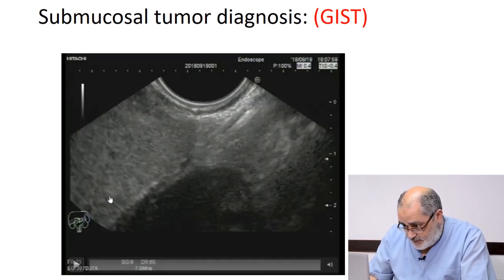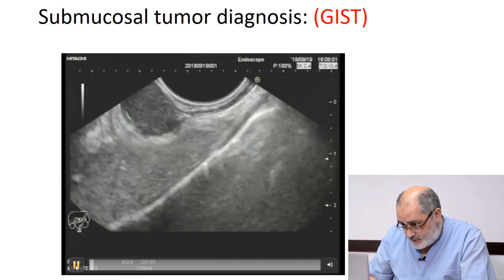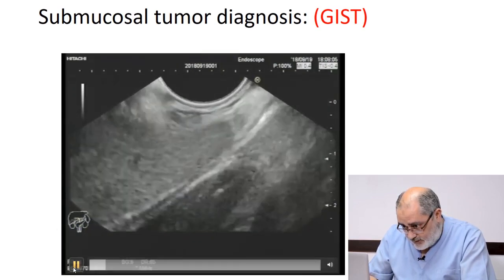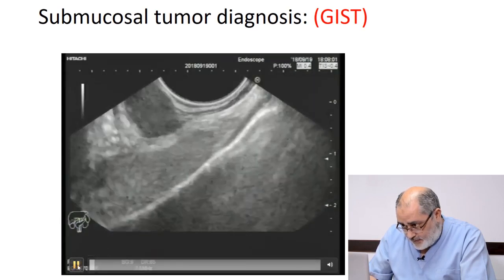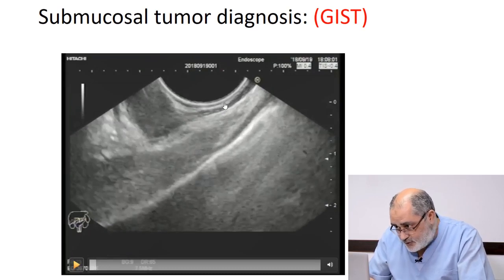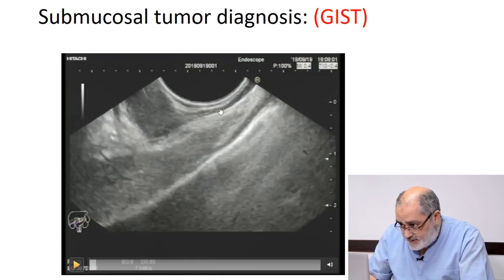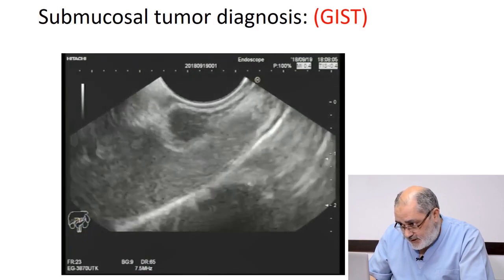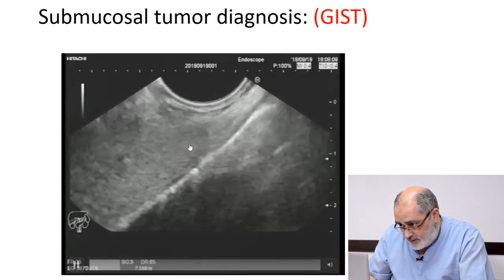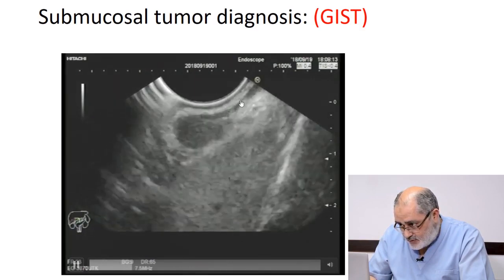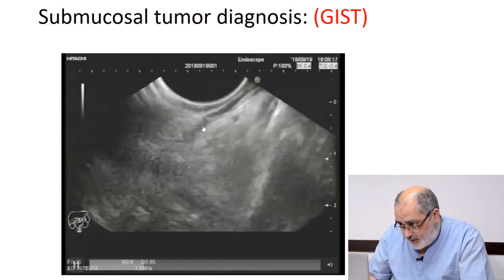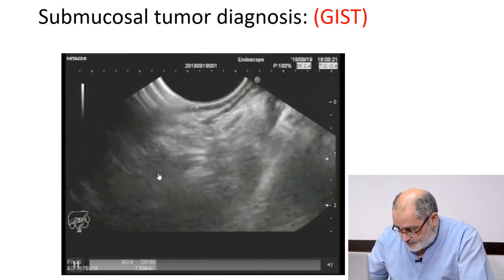This is another example of a small GIST from the stomach. Very nicely seen, it is originating from the fourth layer. Counting the layers again: hyperechoic mucosa, hypoechoic muscularis mucosa, hyperechoic submucosa, and hypoechoic muscularis propria layer. It is clearly seen that this tumor originates from the fourth muscularis propria layer. The most probable diagnosis is GIST. This is the liver — the tumor is indenting the liver but is not originating from the liver; it originates from the muscularis propria layer of the stomach wall.